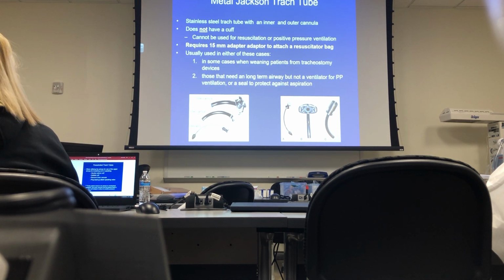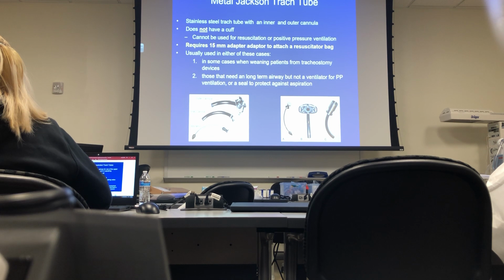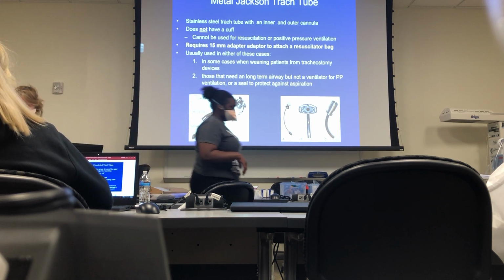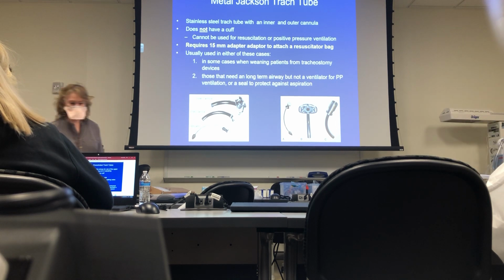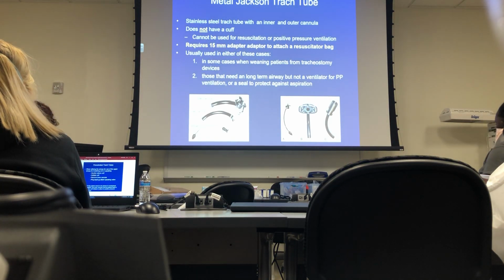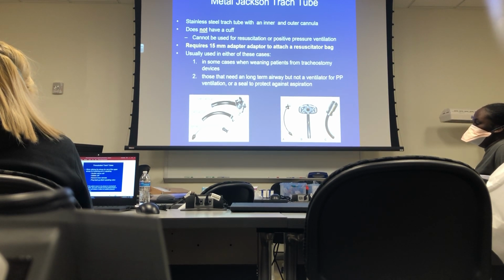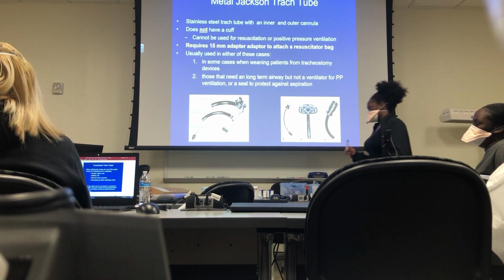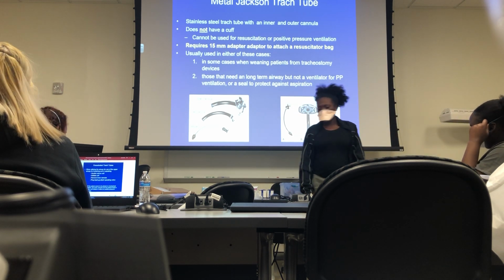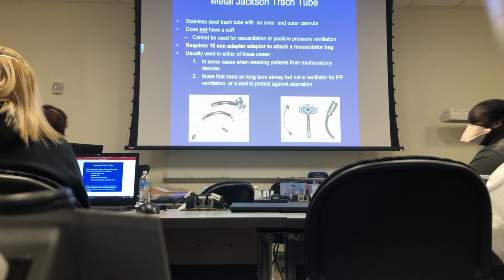Oh, put them in the trach boxes. Oh, you know what, I have one that wasn't right. What is this? This is not right. Regular, yep, regular trachs in here, okay? Got them? Is that a regular trach or fenestrated? No, that's fenestrated. No, it's got a hole. Fenestrated going here. Okay? Fenestrated. No, wait a minute, this is a regular trach. Guys, you're screwing me up. Regulars going here. Make sure those are all regular trachs in there.